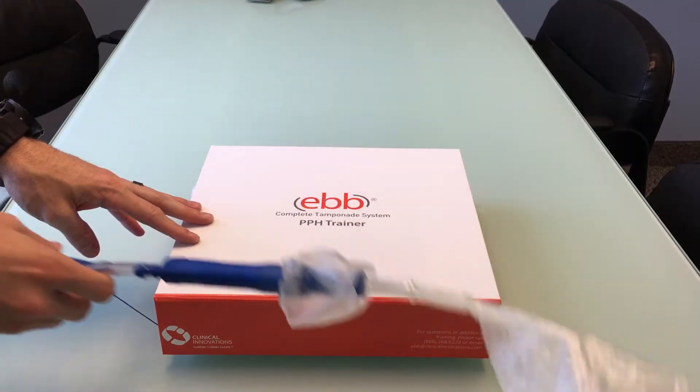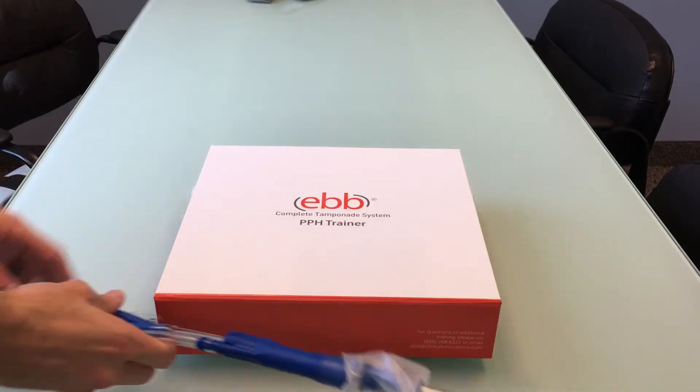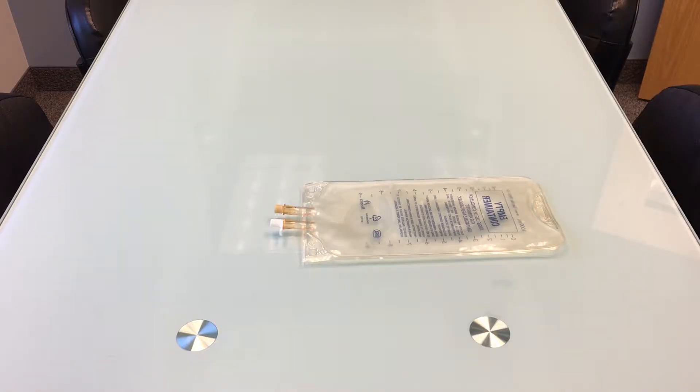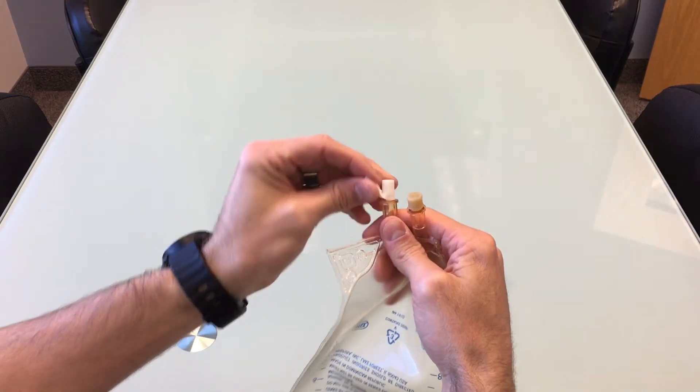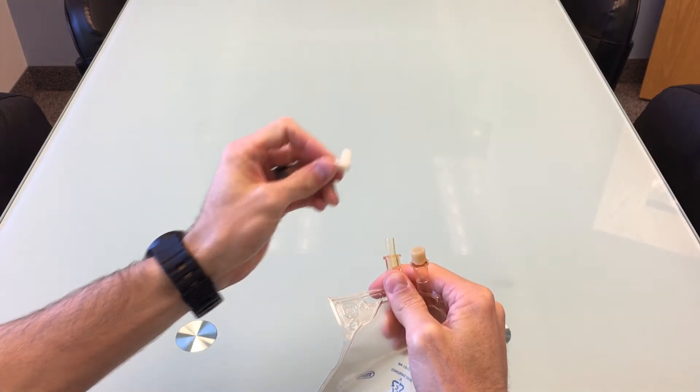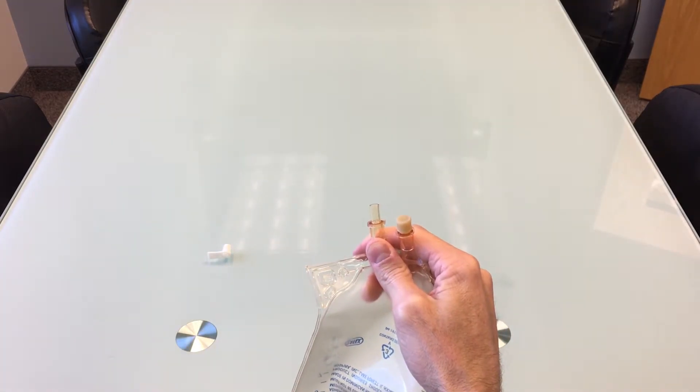The EBB now moves freely for training purposes but will not get lost or misplaced. Now that the box and EBB are ready, we need to prepare the IV bag. To do so, remove the white cap from the IV bag — do not lose it, as you will need to recap the bag once it is filled with air.